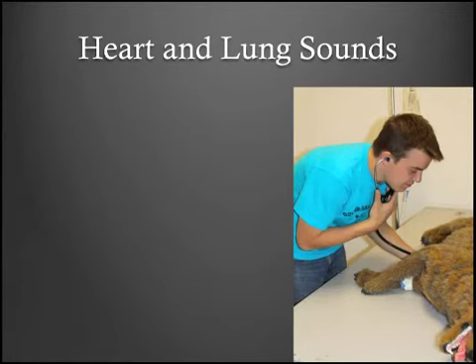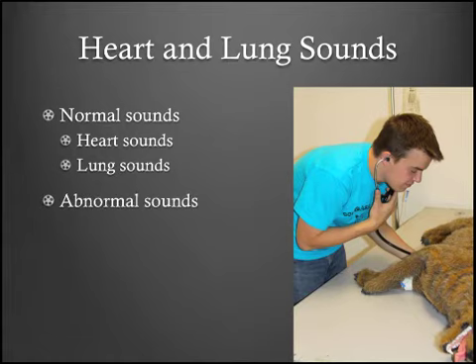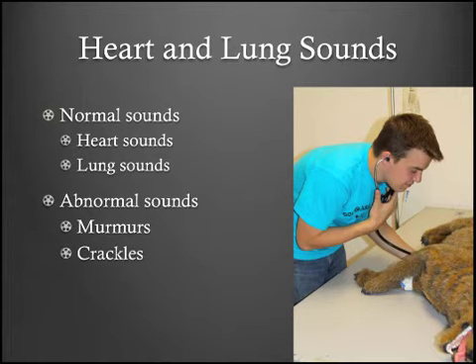Other physiologic feedback includes heart and lung sounds that can be evaluated by a stethoscope. Normal sounds, such as heart sounds, and lung sounds can be simulated, as can abnormal sounds such as heart murmurs, pulmonary crackles, and lower airway wheezes.